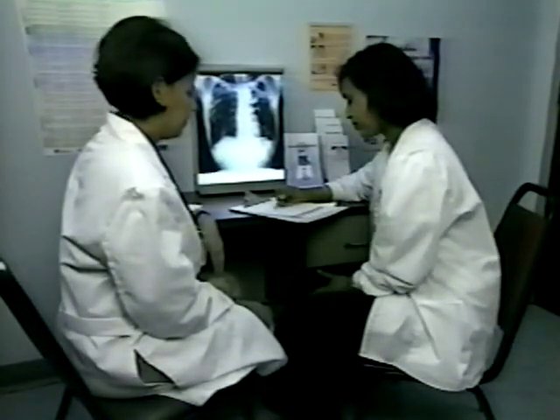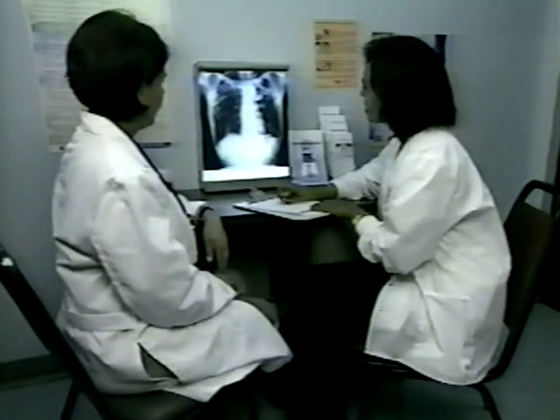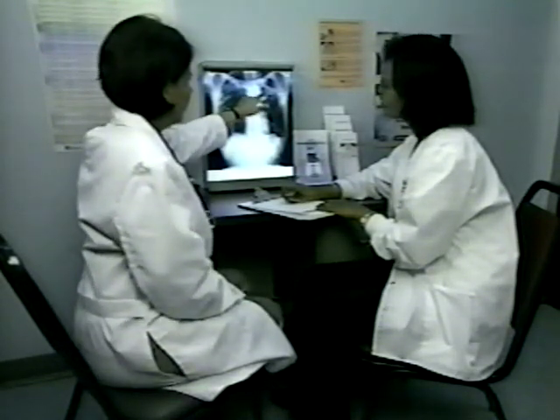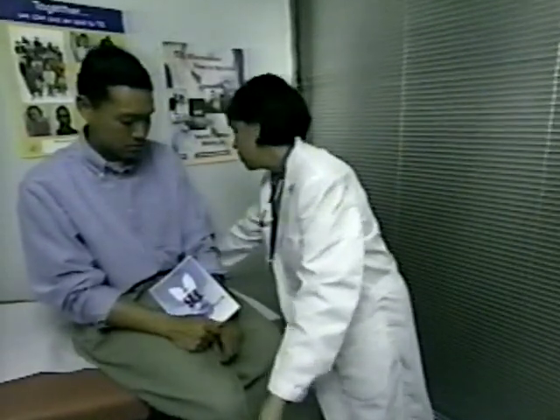Accurately reading and recording skin test measurement results is important and gives the health care provider useful information for evaluation. Results are often used as a baseline or as a comparison with past or future test results. The skin test measurement is then evaluated along with other factors for an interpretation that may lead to further diagnostic and medical evaluation and possibly treatment. Interpretation should be performed by a trained health care provider in accordance with institutional policies based on CDC guidelines.